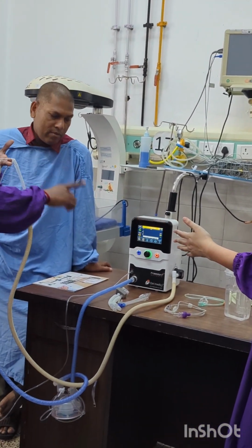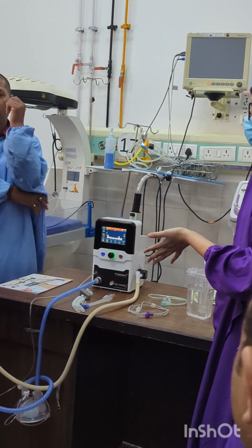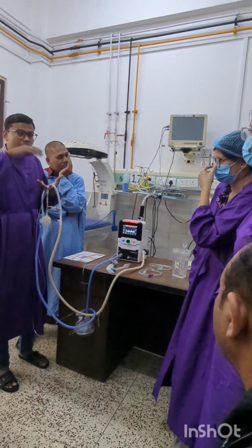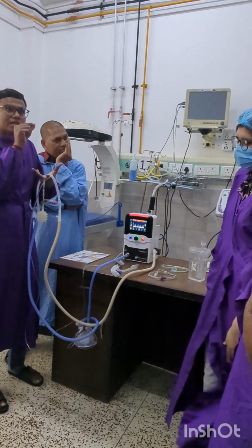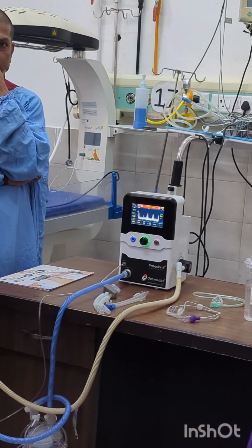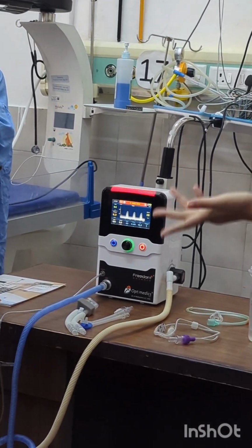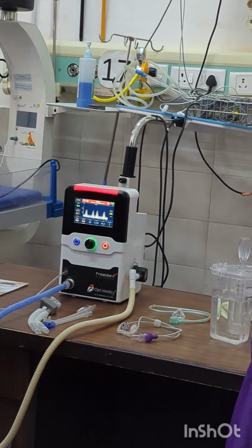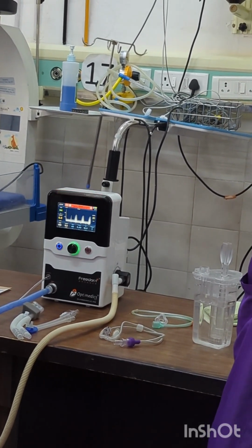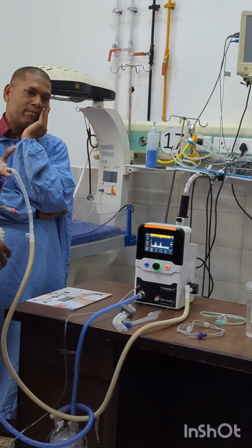Apnea backup ventilation is only in the nCPAP. How are we detecting the patient effort? There is a constant pressure, right? When the patient makes an effort, there will be a drop in the CPAP pressure. Each pressure drop is calculated by the device and it will measure the rate. In bubble CPAP that is not possible. It is only possible in the nasal CPAP when there is a constant pressure going to the leak. So it has started the ventilation. Even with the leak, it is delivering everything. You can see it has stopped because of spontaneous breathing.